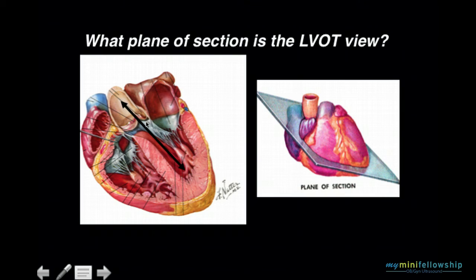Note that on the left side of the heart, the inflow direction is exactly the opposite of the outflow direction. So inflow direction across the mitral valve to the apex goes in the opposite direction as the flow of blood toward the base of the aortic valve.